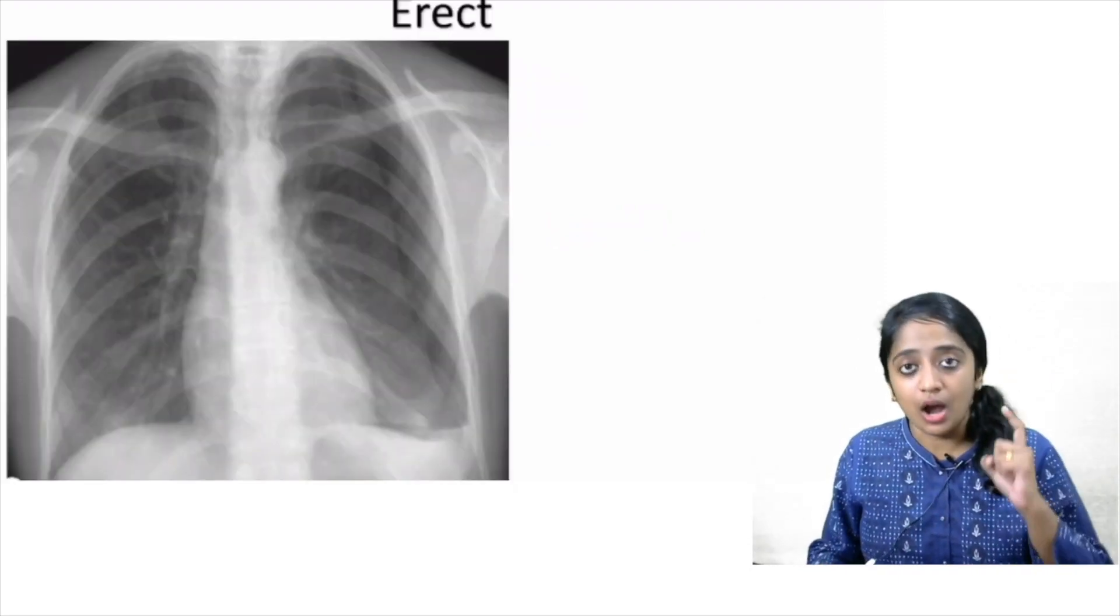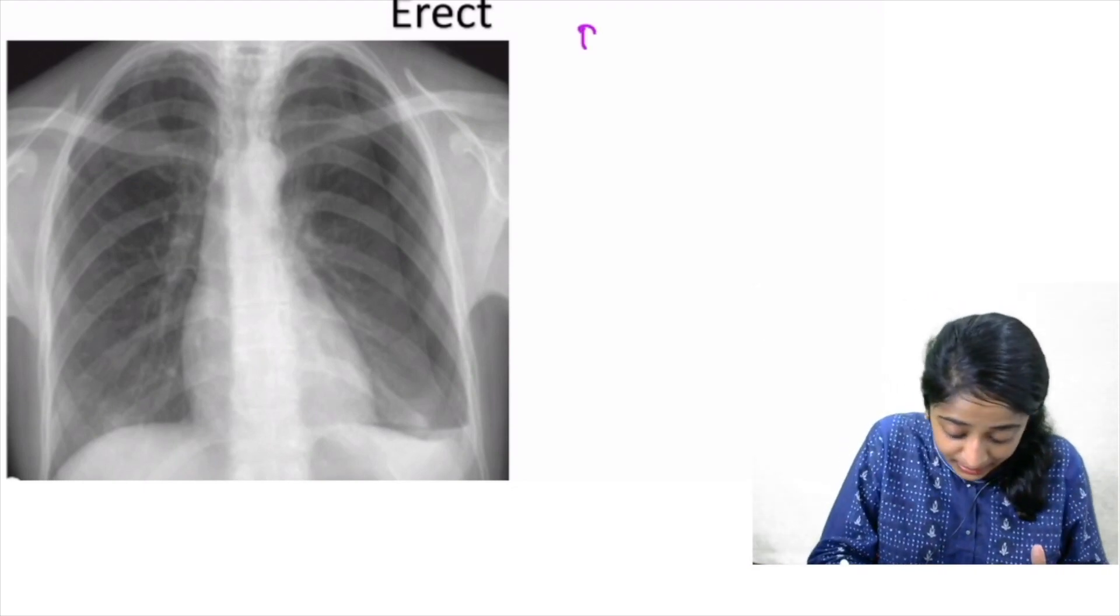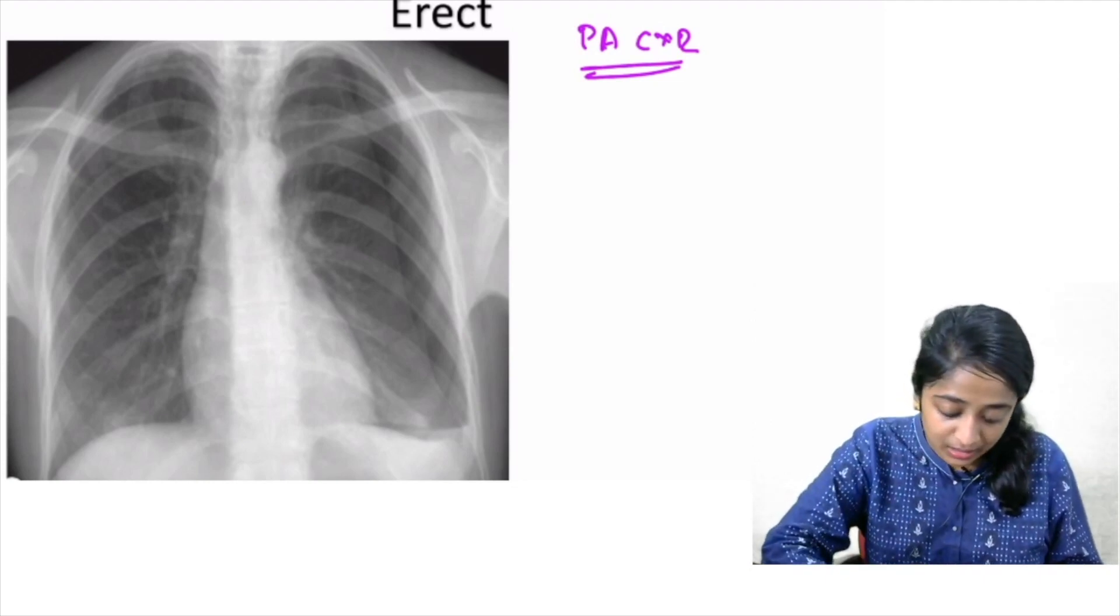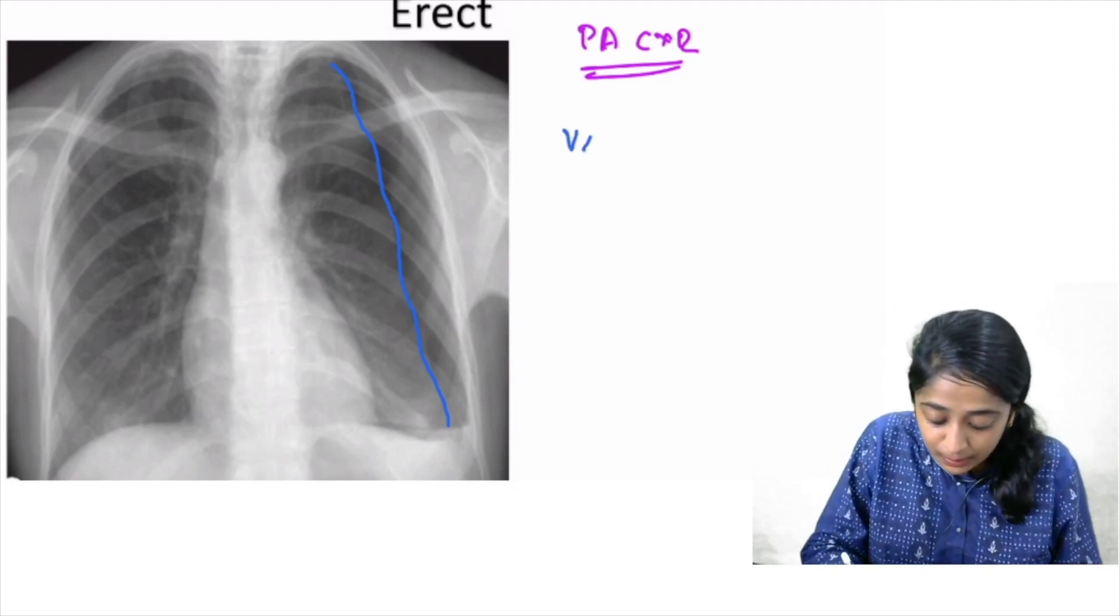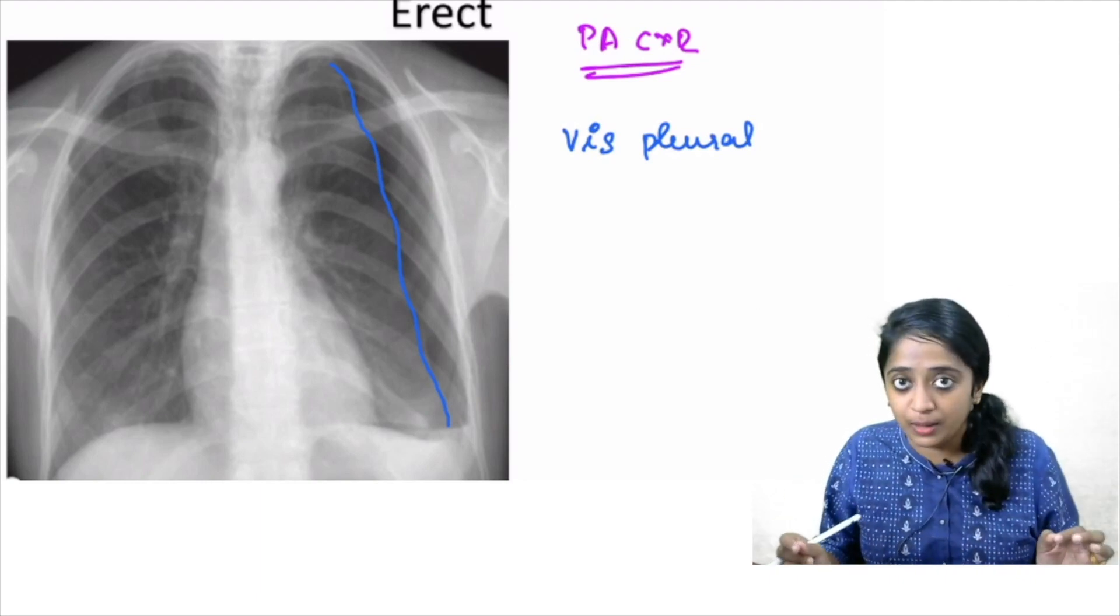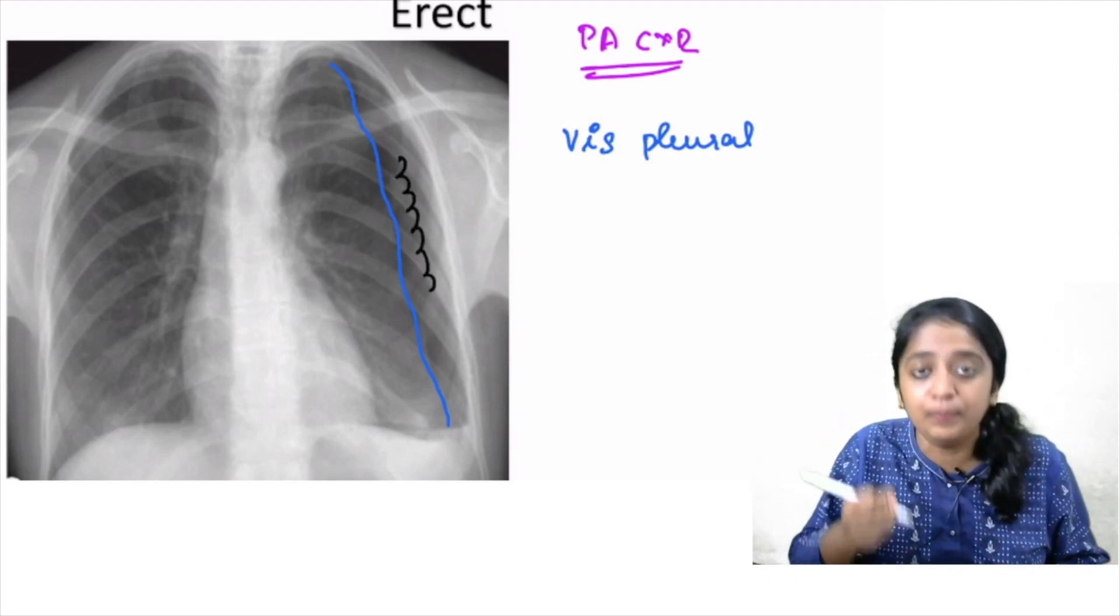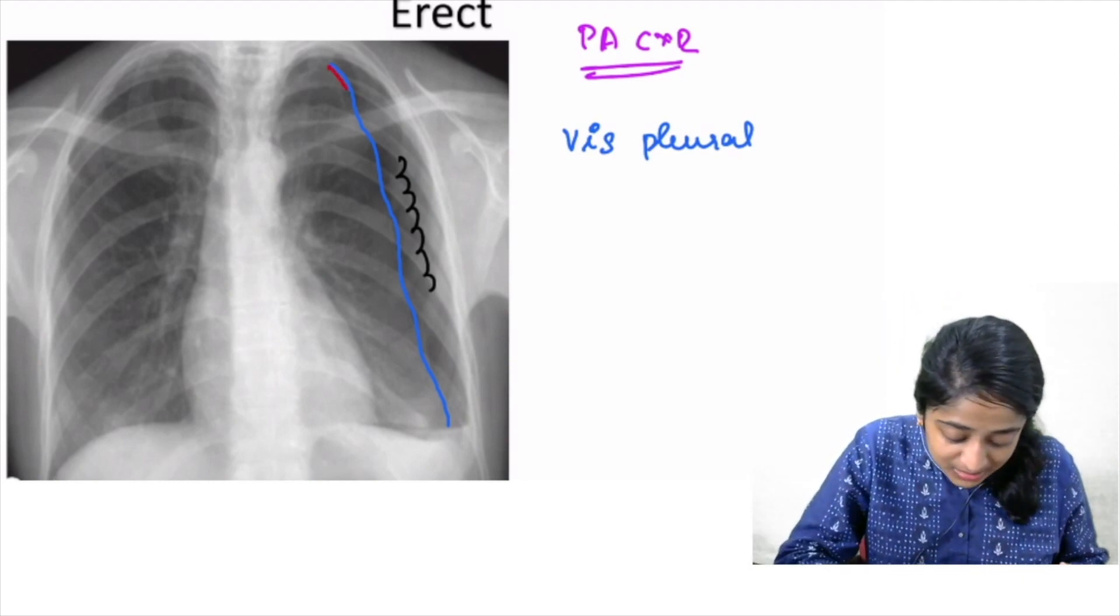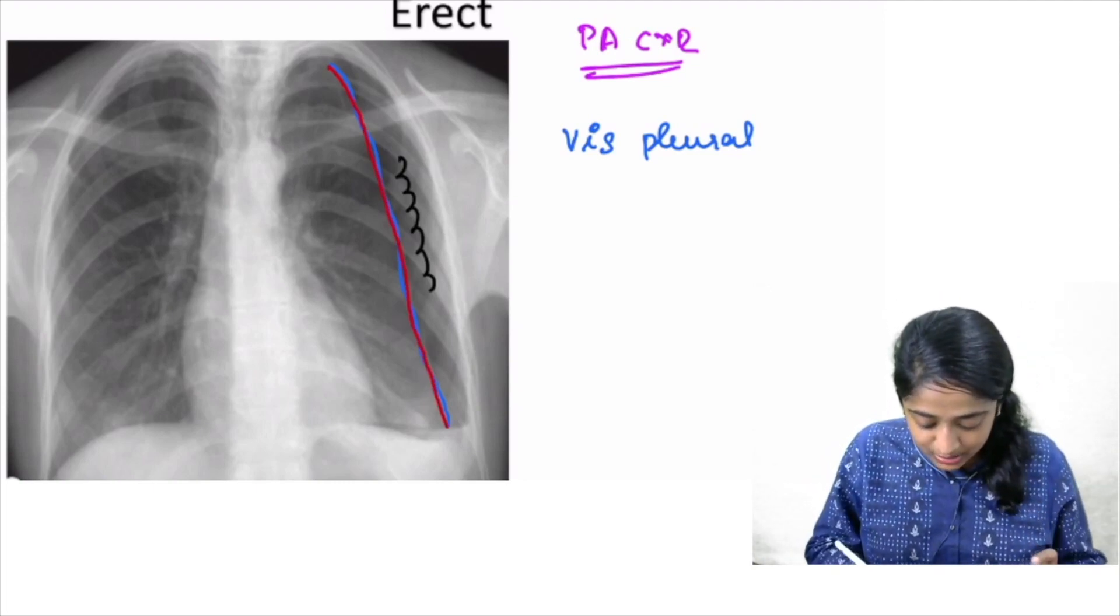Now let's quickly see how pneumothorax appear in radiograph. With erect chest PA radiograph, what are you going to look for? It is clearly shown that there is a white line of the displaced visceral pleura. So this is the visceral pleura line, which is apparently separated from the parietal pleura due to the air trapped within the pleural cavity. So what are the ancillary features that you have to look for? Along with this white line of displaced visceral pleura, you should ensure two more things.